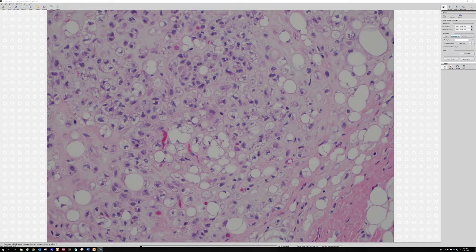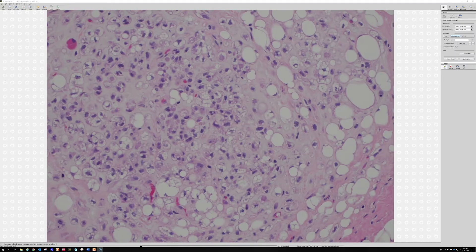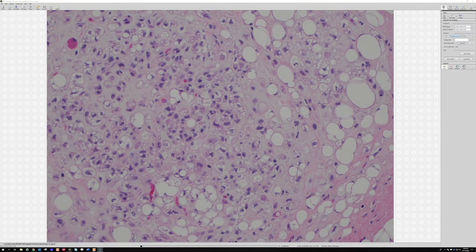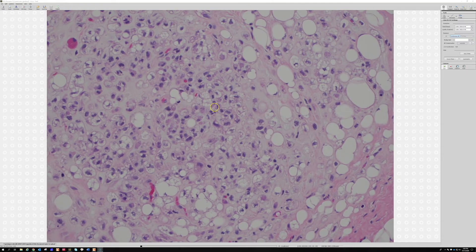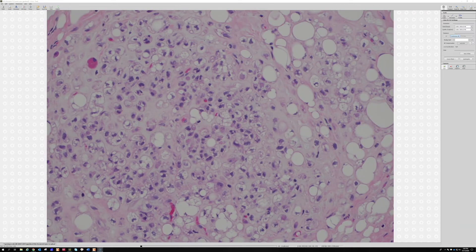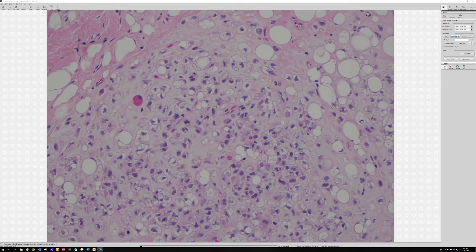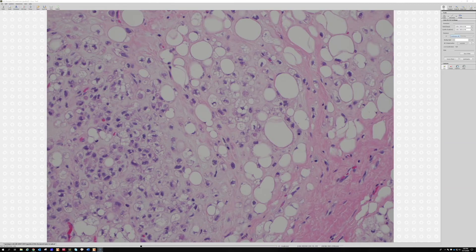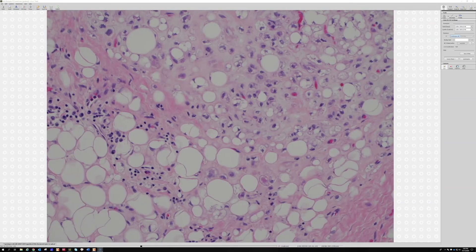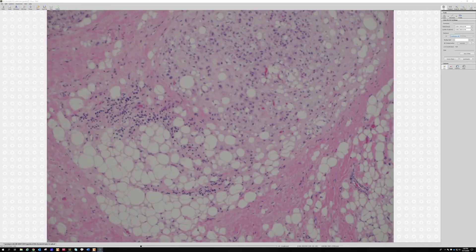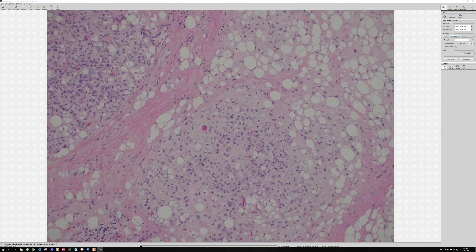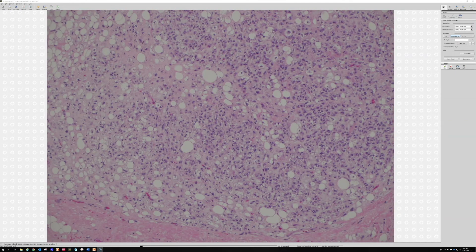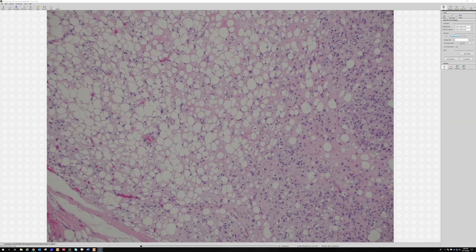Some of them have a slightly granular, reddish, eosinophilic cytoplasm, and others are more bubbly. These are the cells that make the little single cells and little bit of cords and chains in the chondroid areas. So what's the diagnosis then? Chondroid lipoma. Chondroid lipoma, exactly.